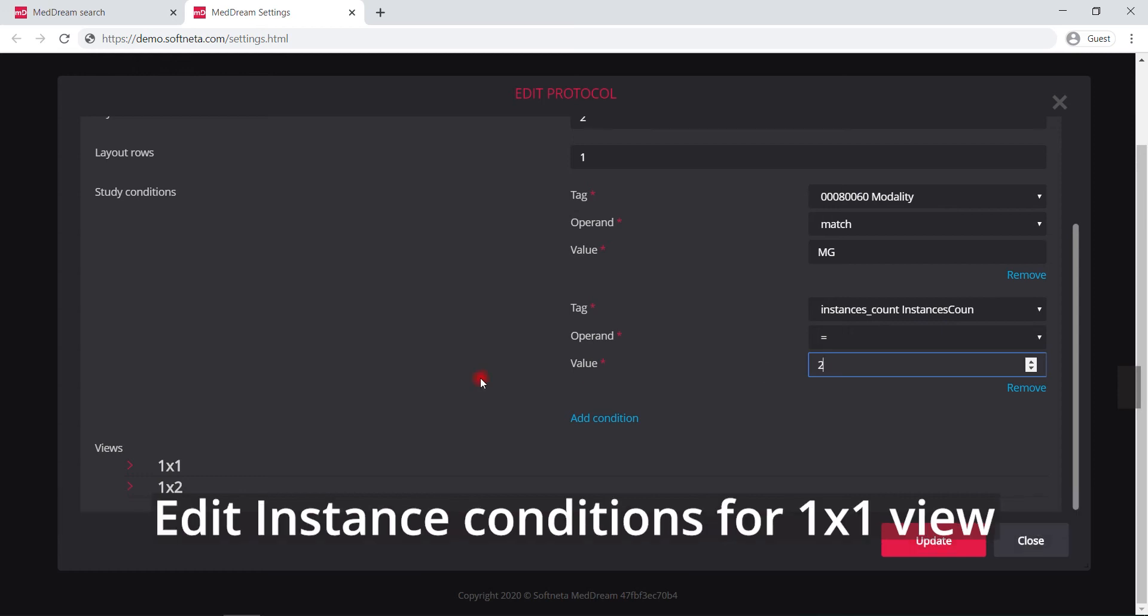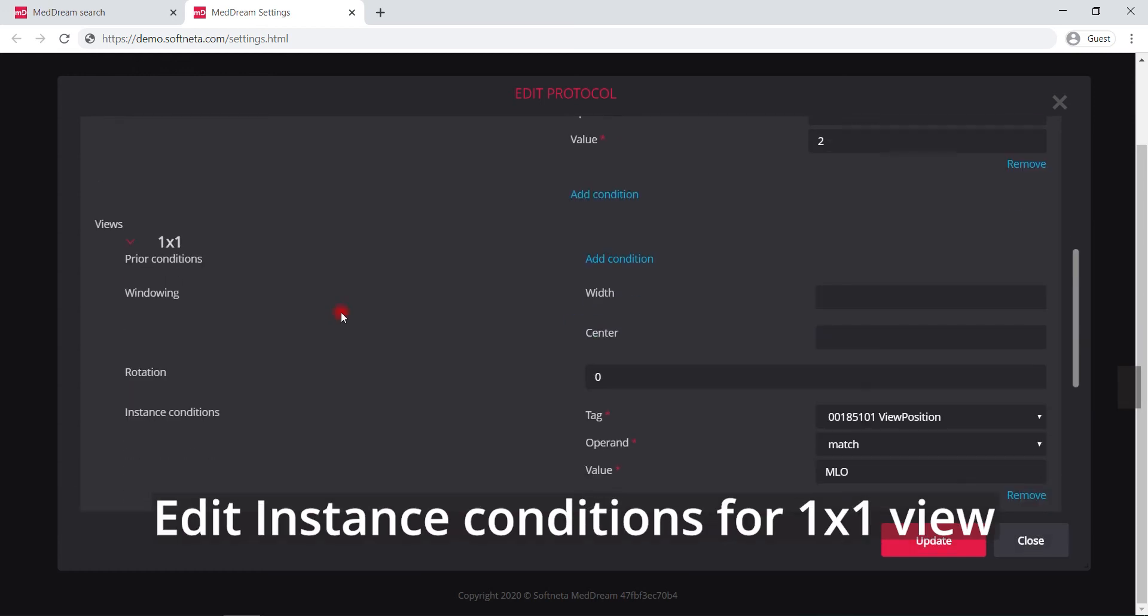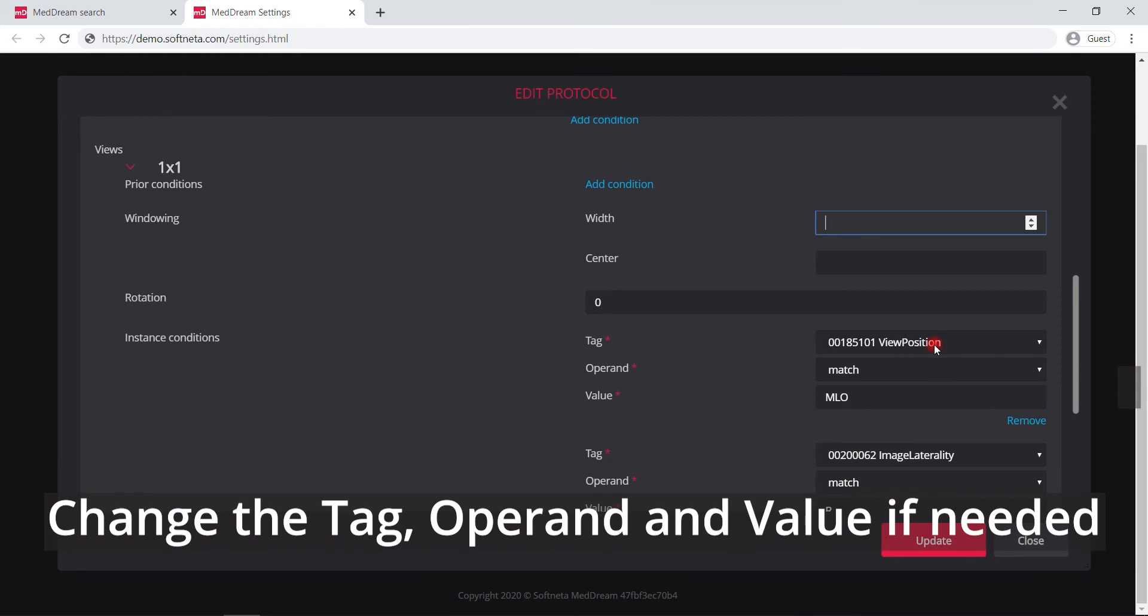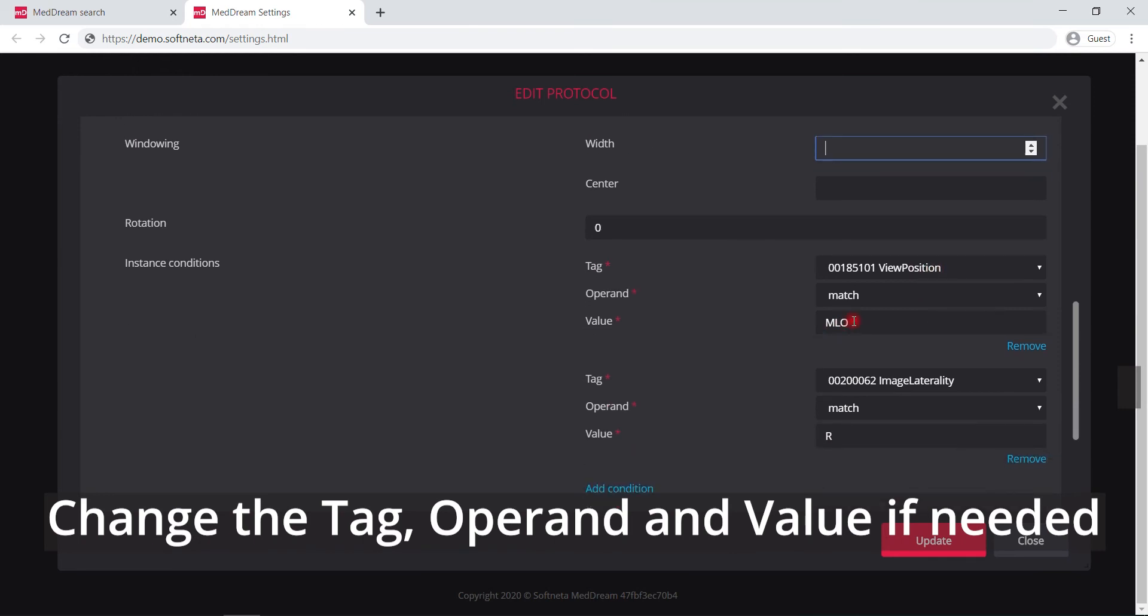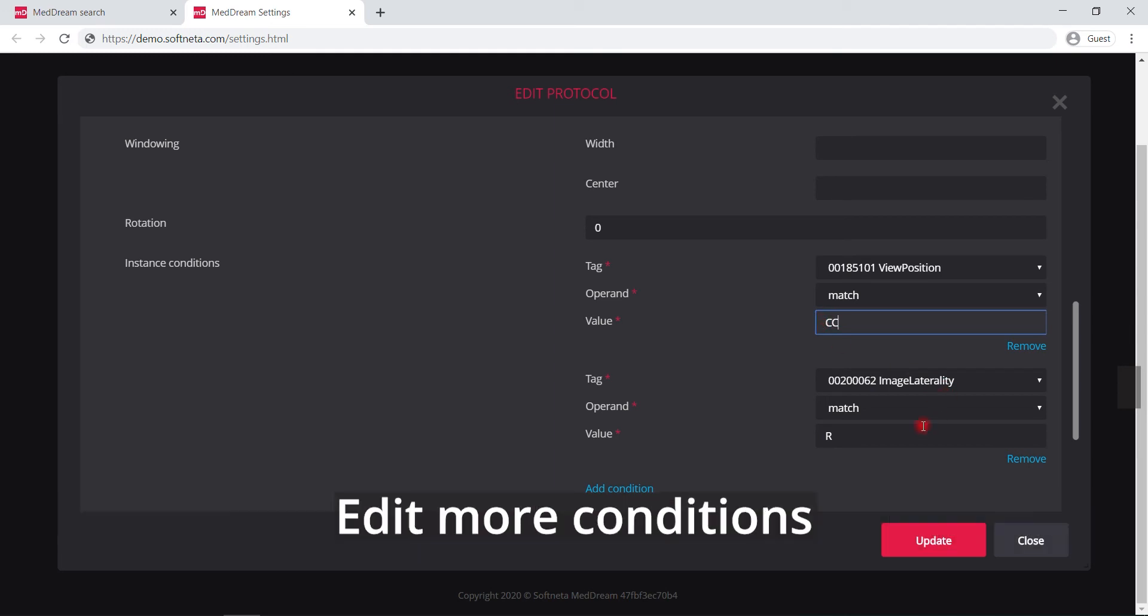Edit the instance conditions for one by one view. Change the tag, operand and value if needed. Edit more conditions.